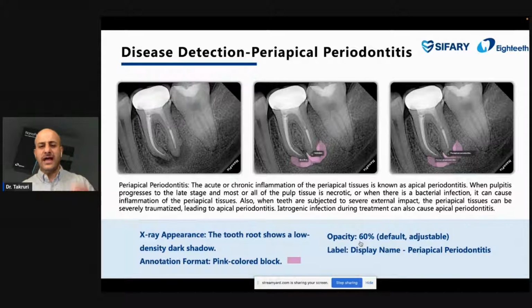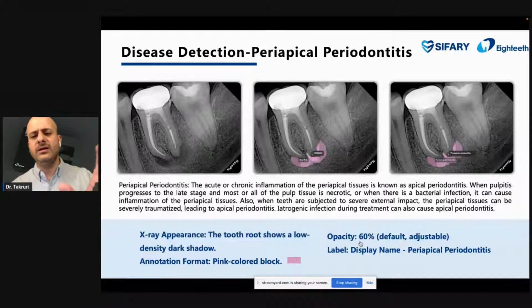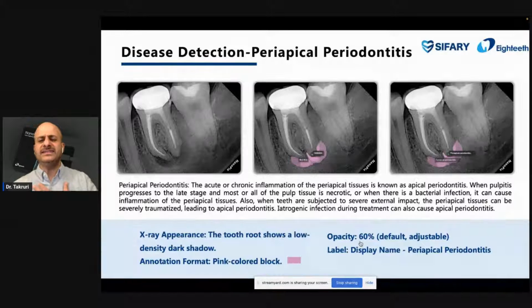And now we are talking about artificial intelligence. This tool, we are just talking about coloring things, coloring periapical lesions, showing canals, root canal filling. For me as a dentist, I can understand that. I don't need this software. But for your patient, it's very important. And with time and with machine learning, this is the most interesting thing.